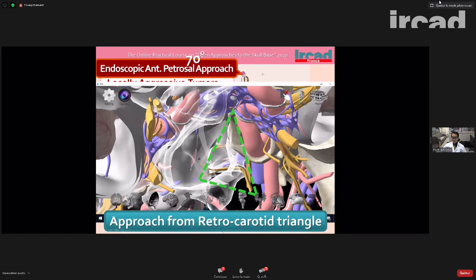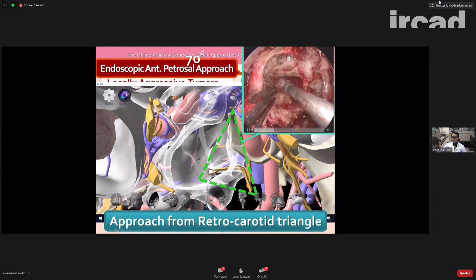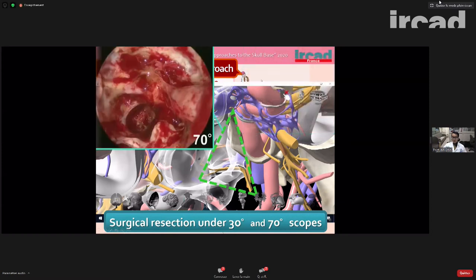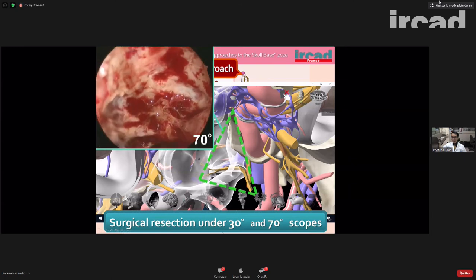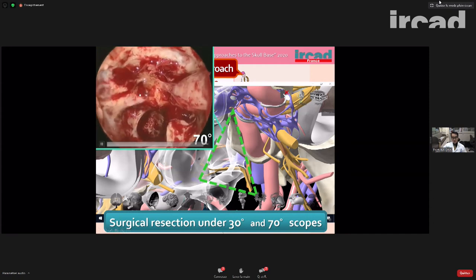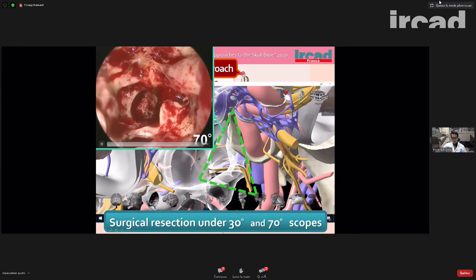So we use this triangle and drill off the clivus, this line, and also the floor of the sphenoid sinus, and also the medial side of the internal carotid artery. Then we can expose the petrous apex tumor. And also, if we remove all the petrous apex, we can directly see the anterior side, posterior side, the trigeminal nerve indentation, the internal carotid artery here, the internal auditory meatus here, the jugular bulb here, and this one is the hypoglossal canal.